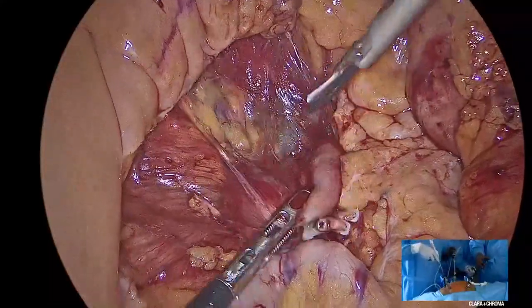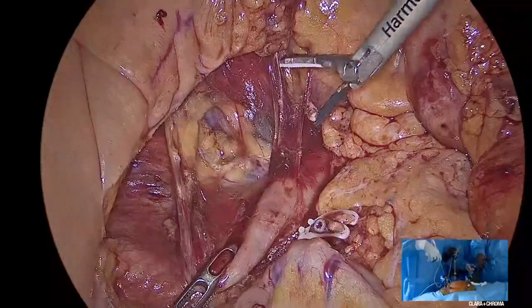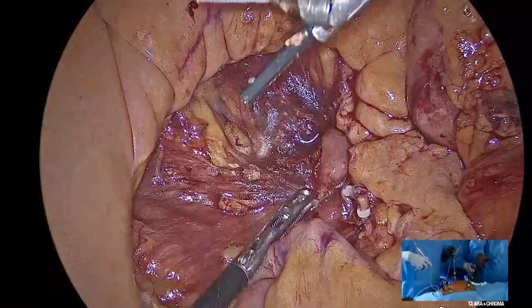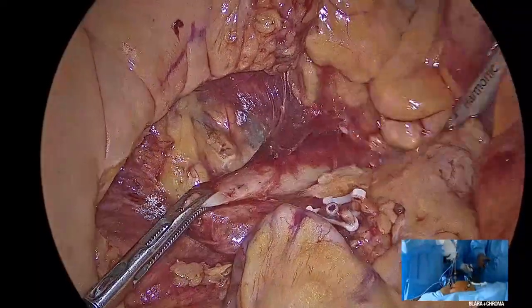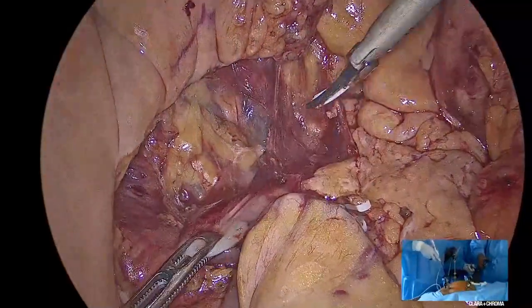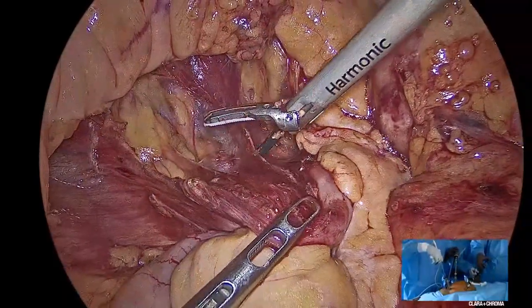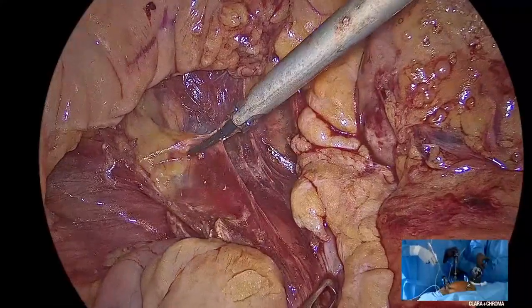So what I'm holding there is the second part of the duodenum, and I'm doing this just to create some more space for me to make my hepatic flexure dissection easier. We generally don't divide the lateral colonic attachment at this stage, because that makes the colon a little more wobbly. It tends to fall into the operative field. So we prefer that the colon stays in its normal position, and we do the mesocolic dissection and the uncinate process dissection first, because that gives you more space. The colon is still attached to the hepatic flexure, to the liver, and laterally to the lateral abdominal wall. This colon is a large structure, and it wobbles and falls into the field. It makes life a little difficult.